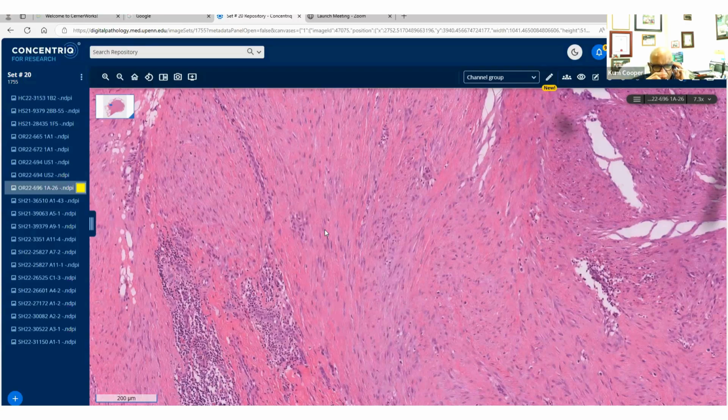The reason I'm not thinking it's far-fetched is because you can get spindling, you can get spindle cells in epithelioid sarcomas as well. So if you do think about it, then it's quite simple to rule out. If you have INI1, that's pretty much sufficient. Keratin, CD34. CD34 is only positive in about 60%, but you can and should rule it out.